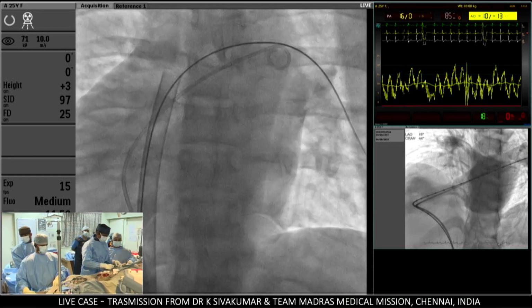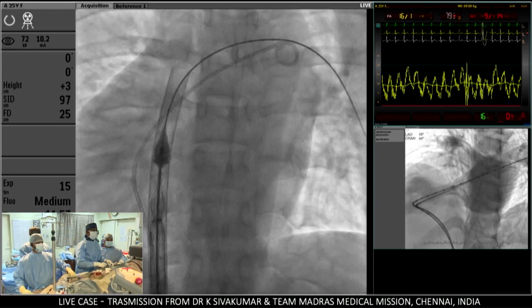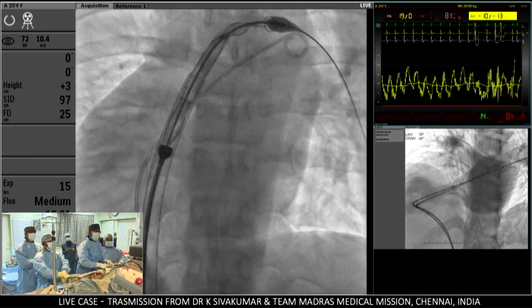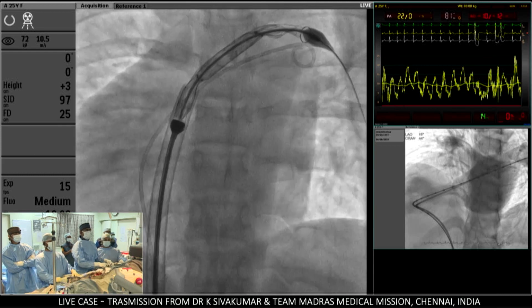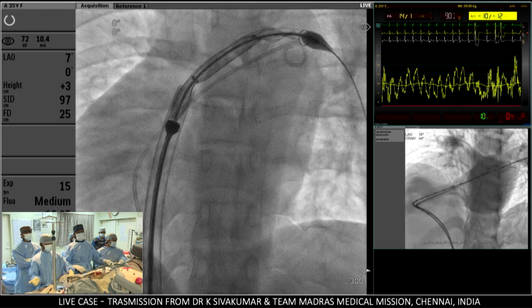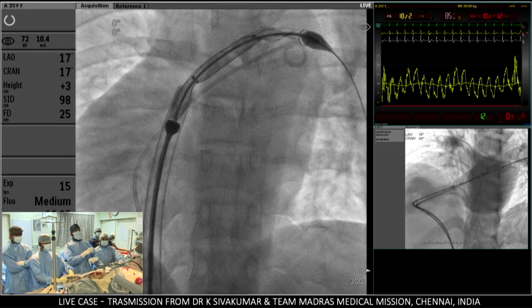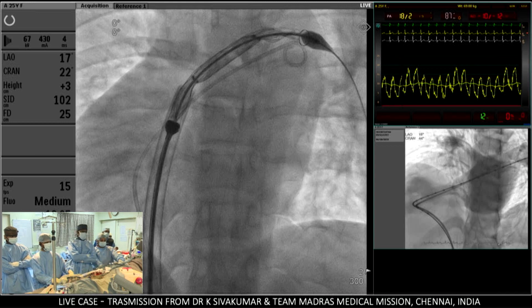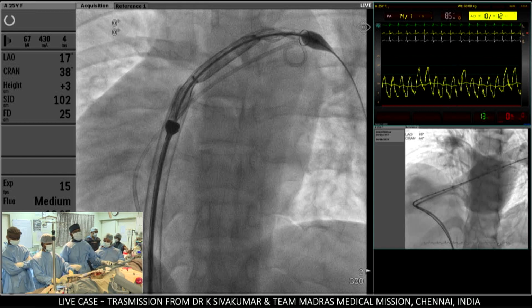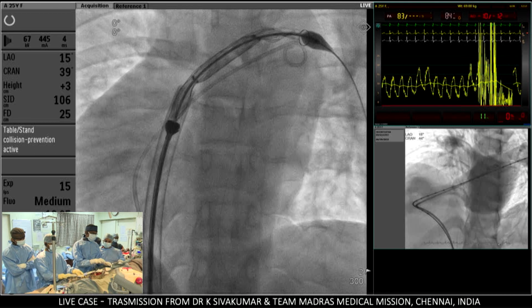I think provided you can put a valve in, there is no way that the stent will be in contact with the wall in the main PA. I wonder if your intention is to put a valve partially straddling the more restricted point at the RV to PA junction, or what? Yeah, I think that's the only position where the anatomy can hold the device in place. You agree with that? I agree, Mario.